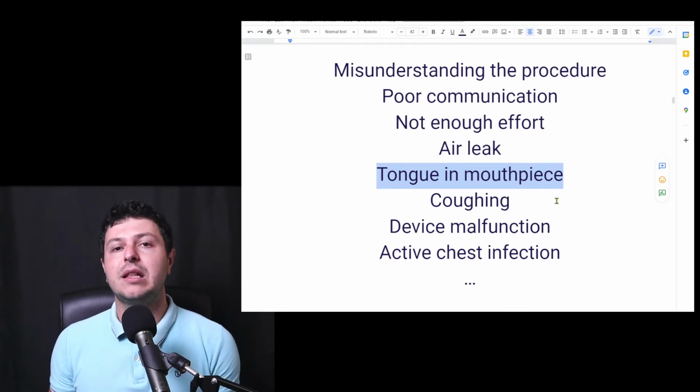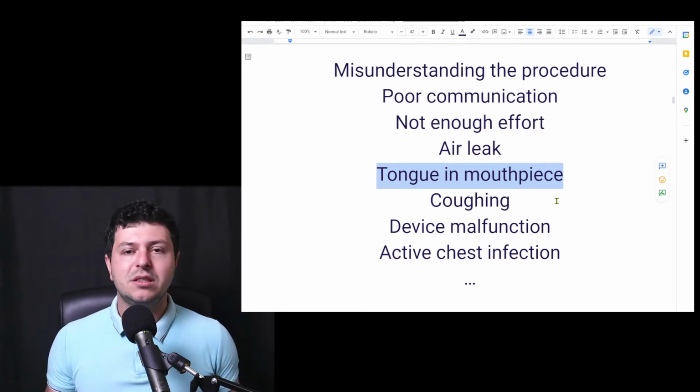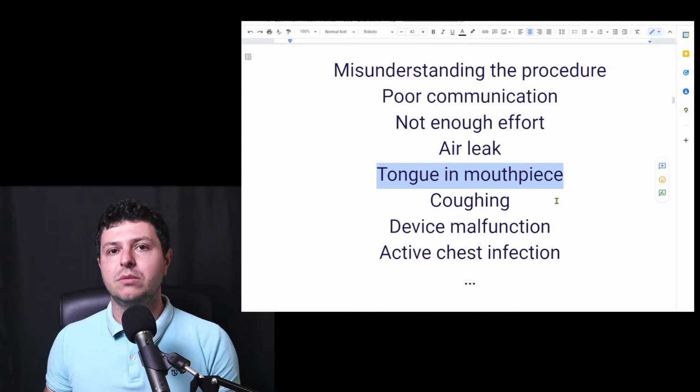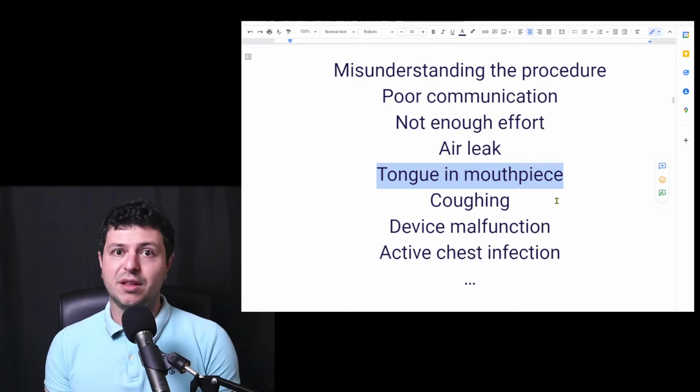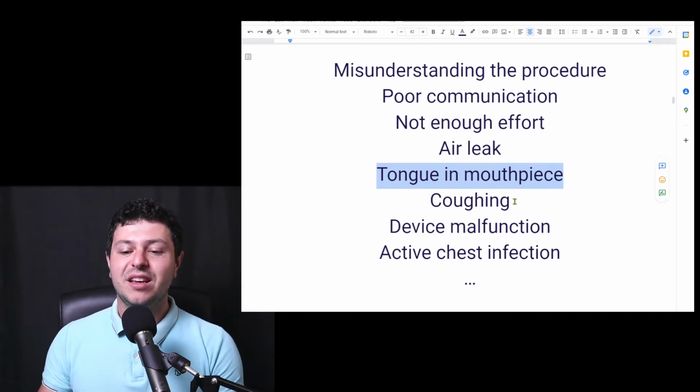And it's something that I'd like to tell you in this video because you should not feel embarrassed. If you need to do a spirometry test, just think about it as something that you need to do. People who are guiding you through this procedure have seen everything. They've seen all the problems that can happen, all the things that have gone wrong. So please, if you go for a spirometry, don't feel like this is going to be very, very bad for you.